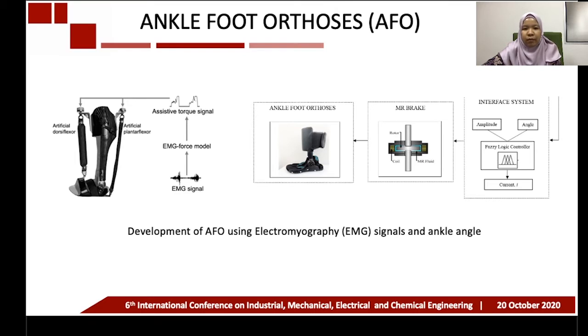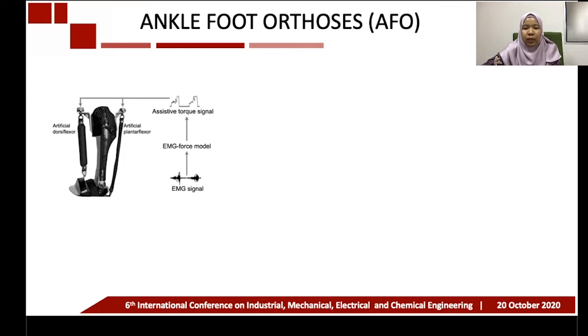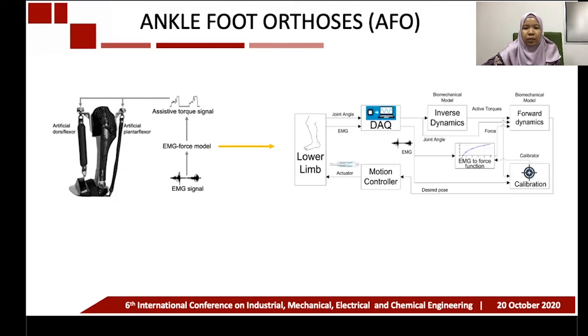Recent studies have developed AFO using electromyography, EMG signals, and ankle angle. One of the studies considered the EMG force model in order to control the actuator of AFO.